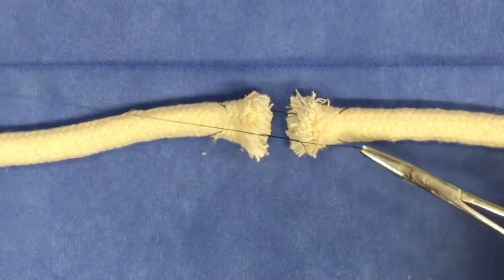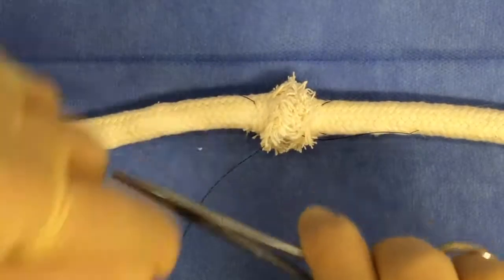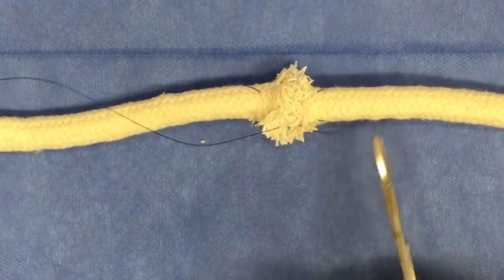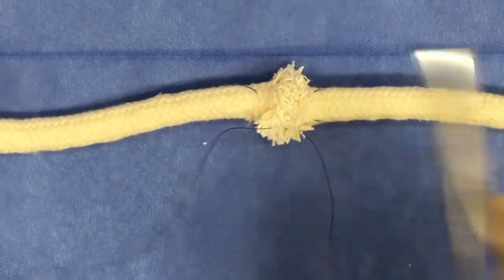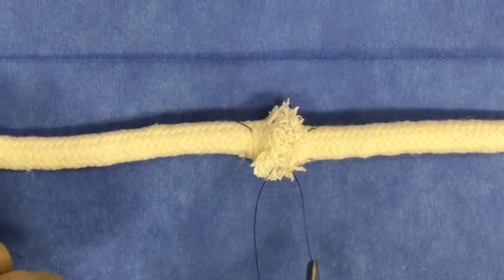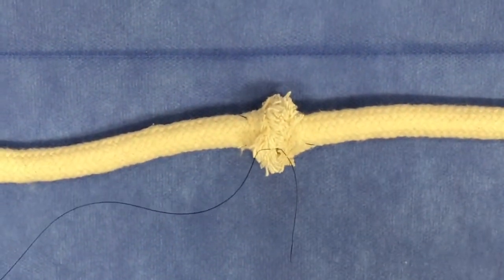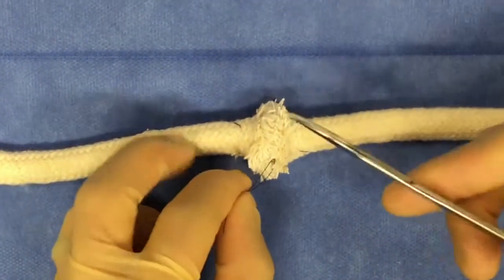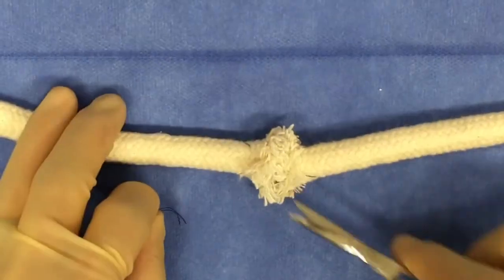Make sure you tie off your square knot within the cut ends of the tendon itself, so there's no exposed knots. Those exposed knots, if they're sitting on the dorsal or ventral surface of the tendon, can lead to friction, adhesions, and problems as that tendon is healing, which can be noticed by the patient as a little bump or even affect the glide of that tendon over time. You'll cut close to the knot for this same purpose.